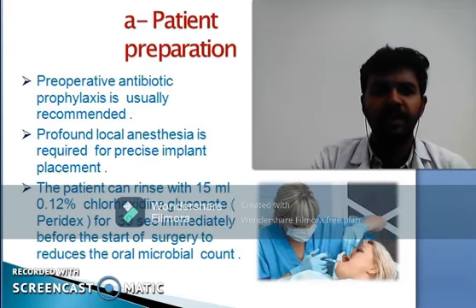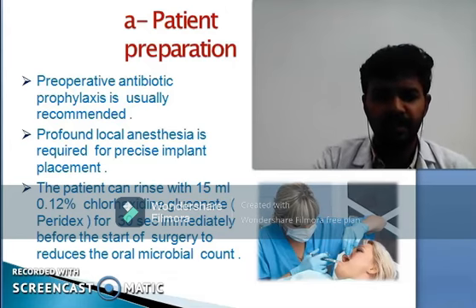Patient preparation: preoperative antibiotic prophylaxis is usually recommended. Profound local anesthesia is required for precise implant placement. The patient can rinse with 15 ml of 0.12% chlorhexidine gluconate for 30 seconds immediately before the start of the surgery to reduce the oral microbial count.